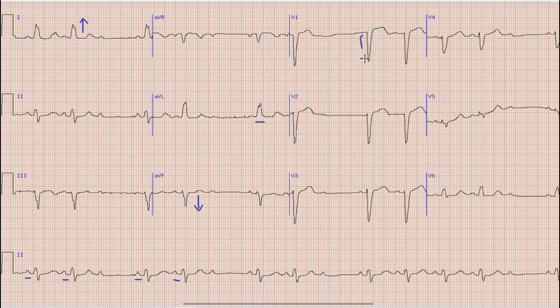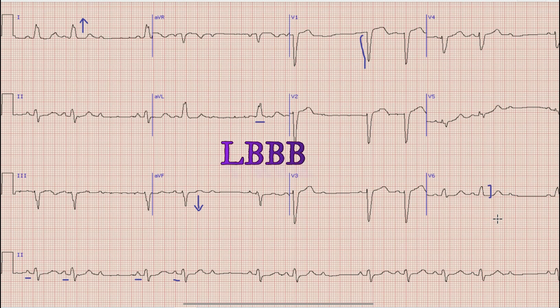Here we can see that there is a deep S wave in lead V1 along with an R wave in lead V6 without any S wave. Presence of a deep S wave in lead V1 along with an R wave in lead V6 means that this is a left bundle branch block.